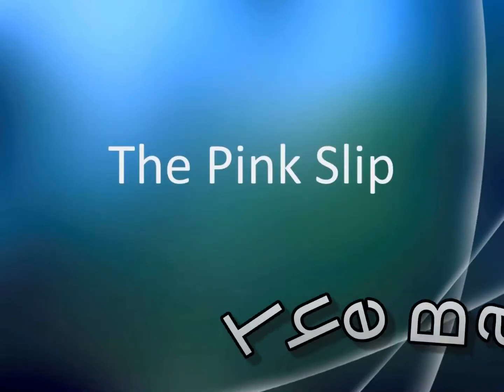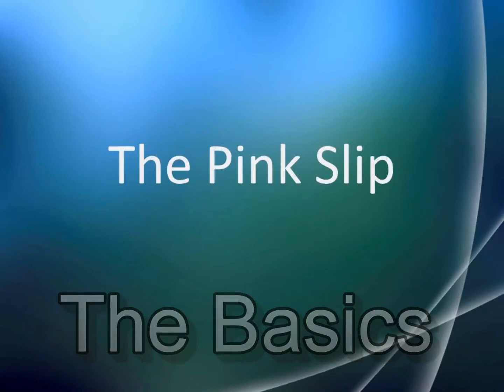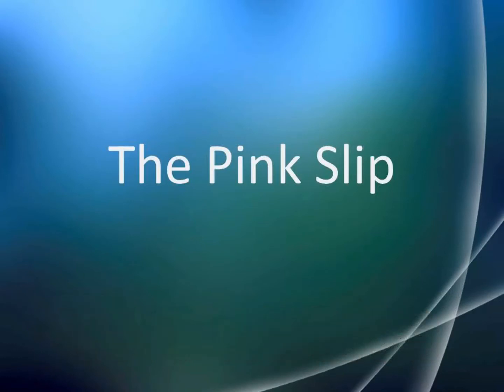Pink slip is a friction-reducing device to aid in repositioning and lateral transfer of patients. It is designed for single patient use, but can be used repeatedly for the same patient during their stay unless damaged. Do not leave under the patient after use. Store at the bedside.